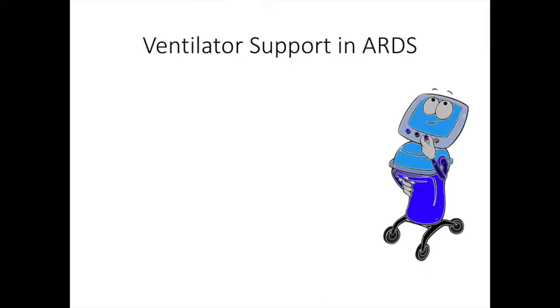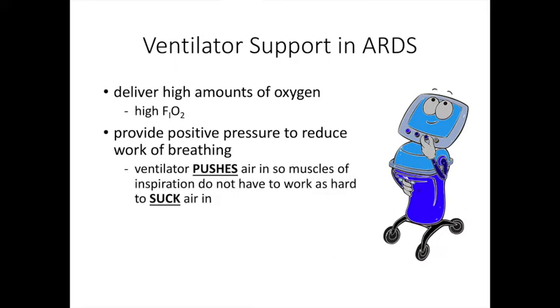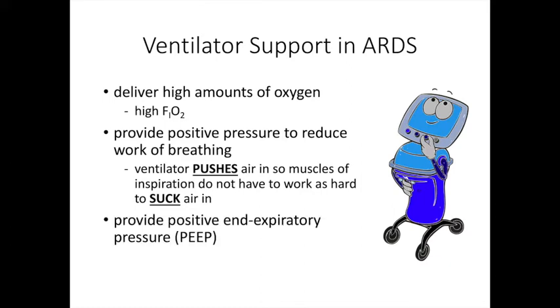Ventilators are frequently required to support patients with ARDS. They deliver high amounts of oxygen and can achieve FiO2s as high as 100%. They provide positive pressure to reduce the work of breathing. A ventilator pushes air in so muscles of inspiration do not have to work as hard to suck air in. And they also provide positive end expiratory pressure, also known as PEEP. PEEP prevents open alveoli from collapsing.